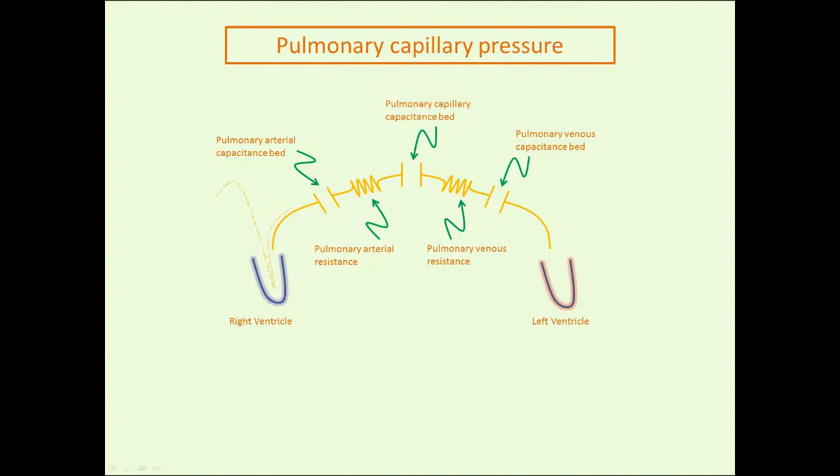So in this cartoon, I want you to consider you've now floated this pulmonary artery catheter into the right ventricle and out into the pulmonary bed here, and you're measuring the pressure across this convoluted, very bright and squiggly circuit that I have highlighted for you today.